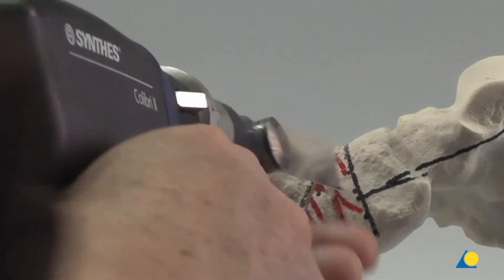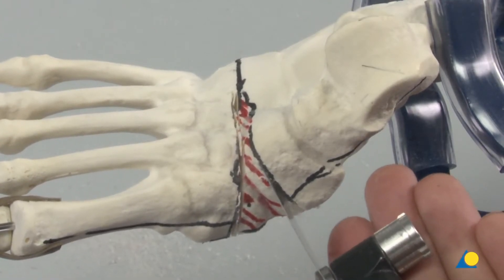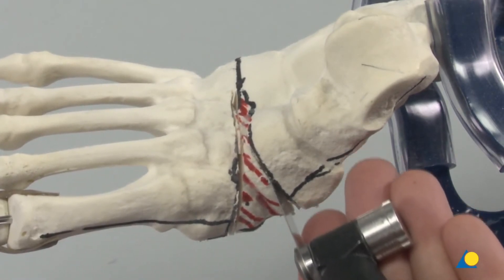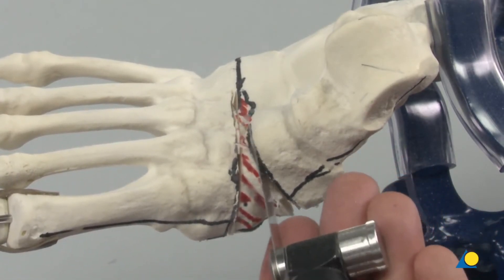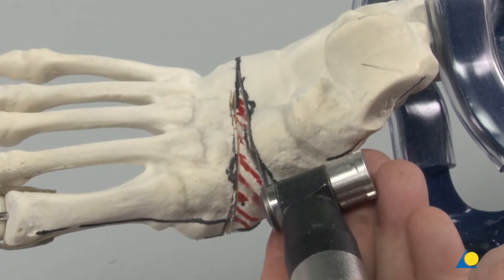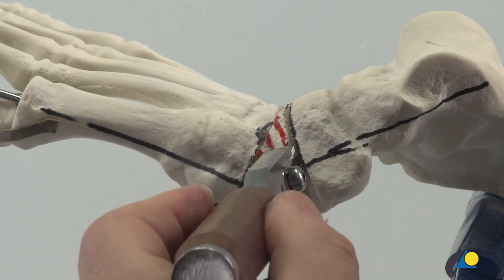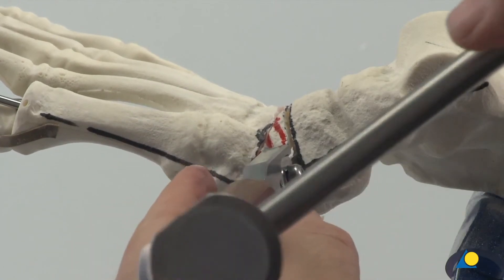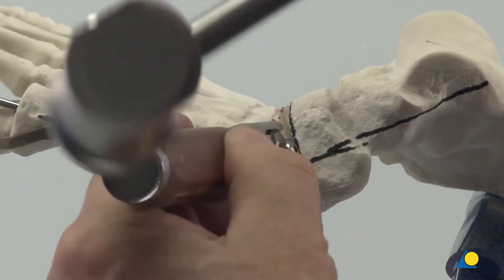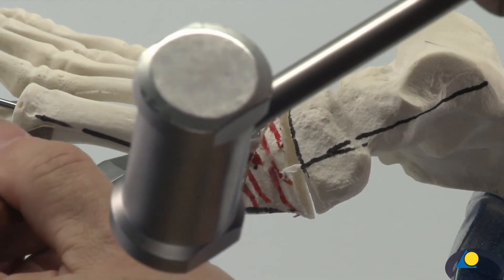The proximal cut is sawn perpendicular to the axis of the hindfoot. An osteotome can be used to complete the osteotomy. If necessary, the osteotomy can be refined with supplemental cuts.